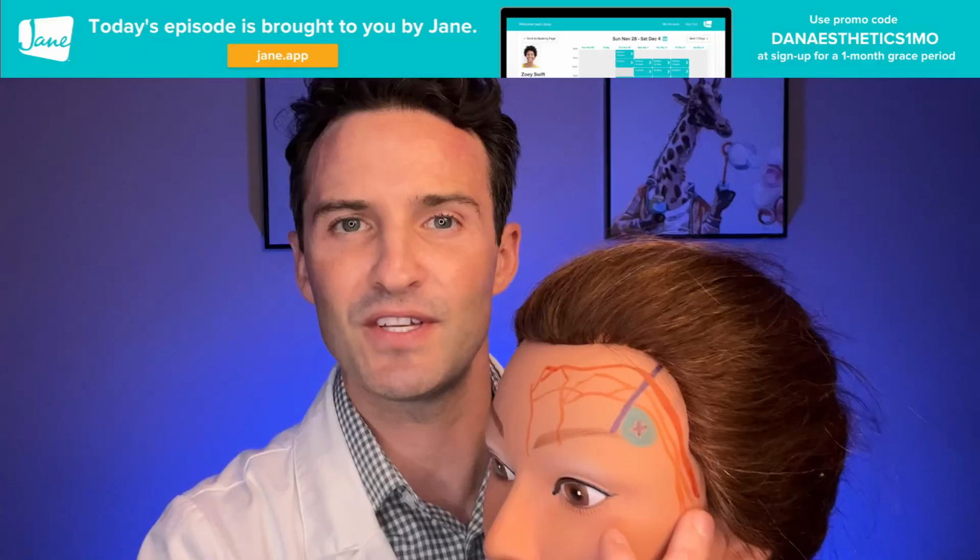So this is the temporal crest, which is this little line right here that you can feel the bone, the orbital rim, and also the upper zygoma. This area is the temple region, the entire temple region that I want to address and make sure it looks seamless. And then after that, I want to identify exactly where these arteries are.